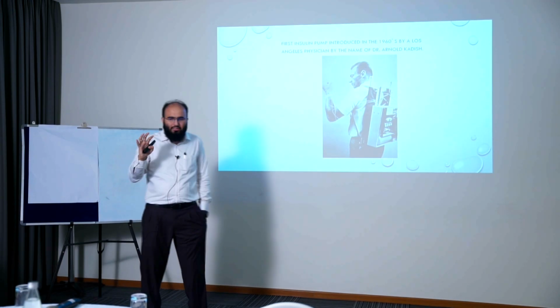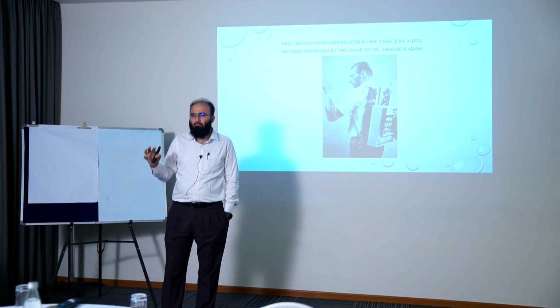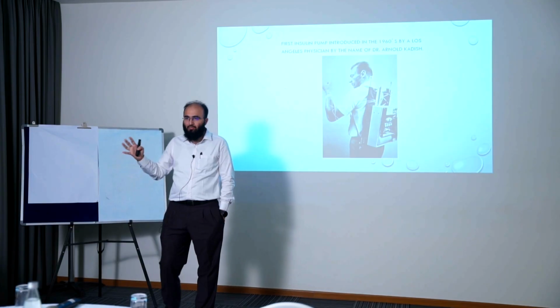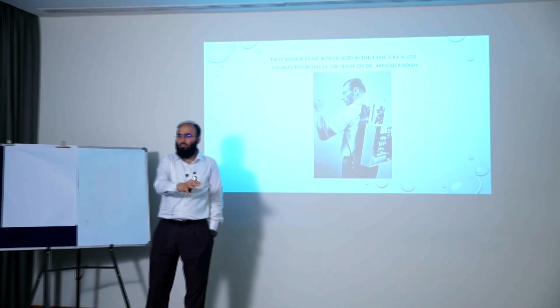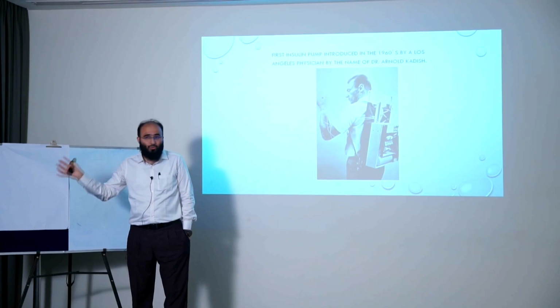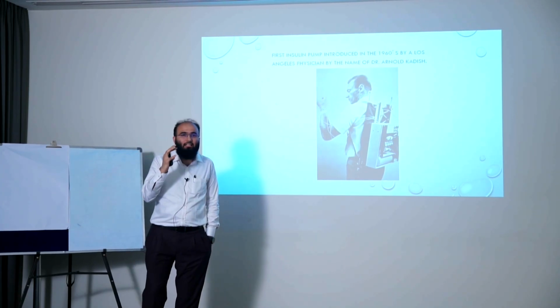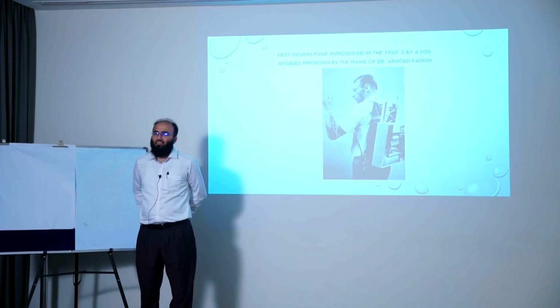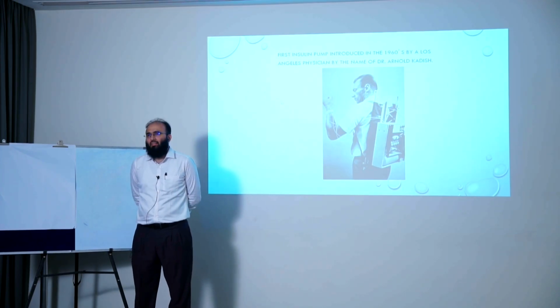My question to you is, why aren't we even talking about a pump when there are so many insulins out there, literally. Rapid-acting insulins, short-acting insulins, co-formulations, premix insulin, regular insulin, basal insulin, and why do you still need a pump? Anybody? We can't continuously monitor and keep on giving insulin. So the pump will enable us to monitor and also pump insulin according to the requirement of the body.